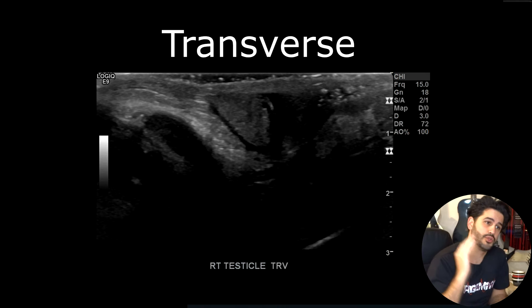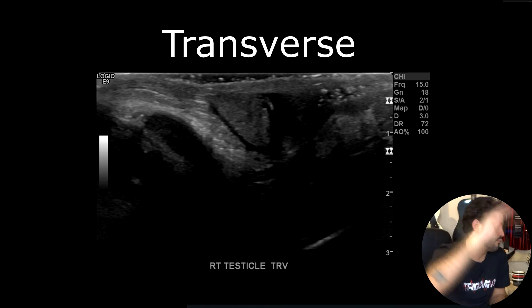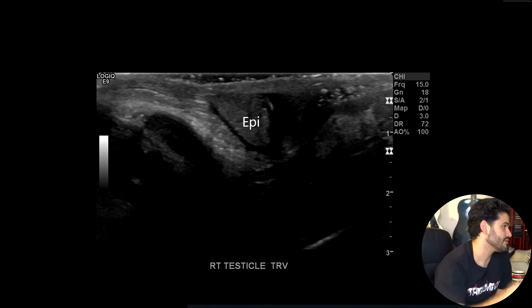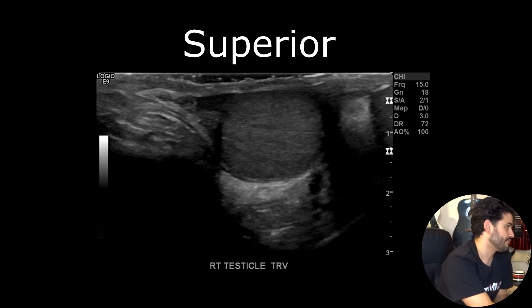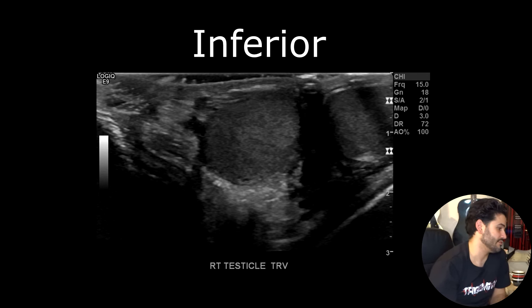Once you're done with the sagittal images, you want to go to transverse, beginning at the superior pole of the testicle with the epididymis. Start at the epididymal head and move down from there — epididymal head first, then the superior pole of the testicle, then the midsection, and then the inferior pole of the testicle.